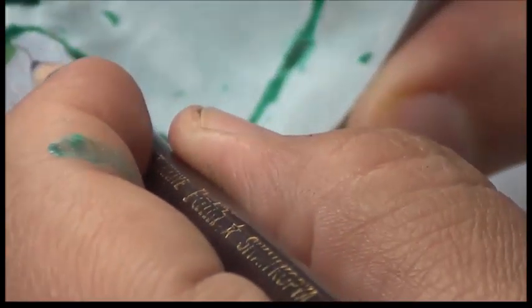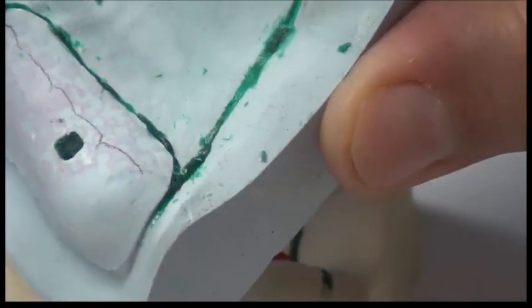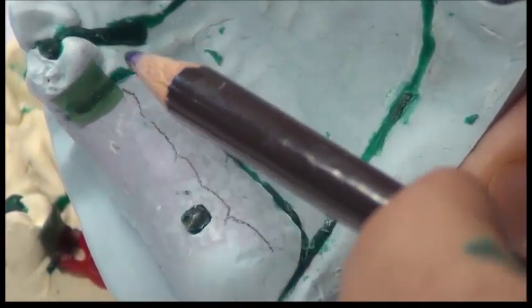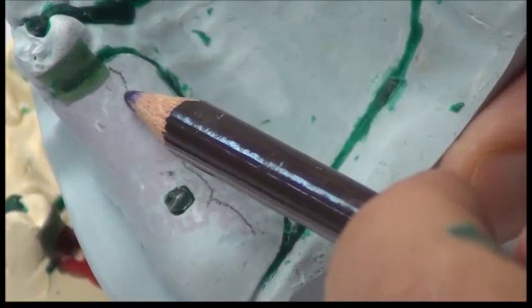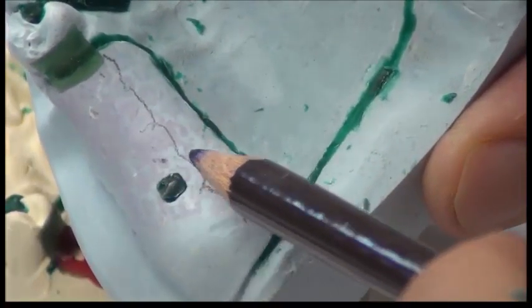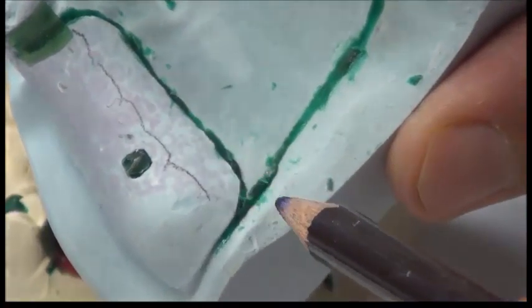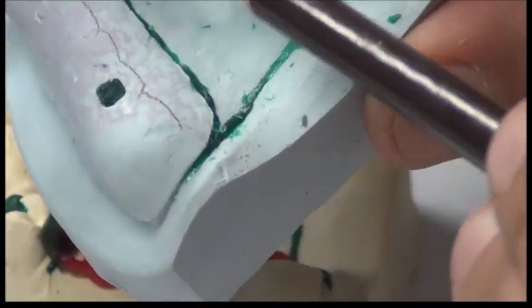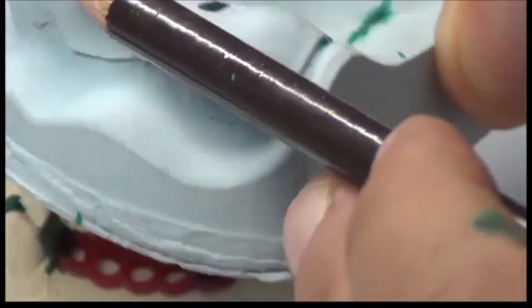So if I'm going to add teeth here, they will almost be placed in this location, okay? So the idea is to imagine where the teeth will be added. So this is the marginal gingiva of the natural tooth. When I add another tooth, I'm going to add the marginal gingiva here, marginal gingiva here, and so on. And remember that we make marginal gingiva using acrylic. So it's not only the tooth placed, we also have acrylic extending.